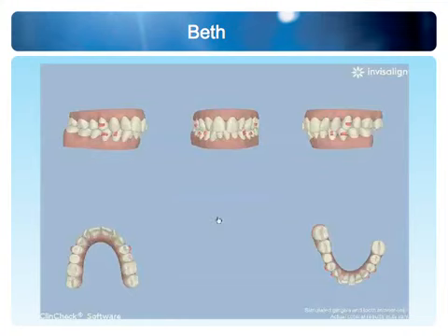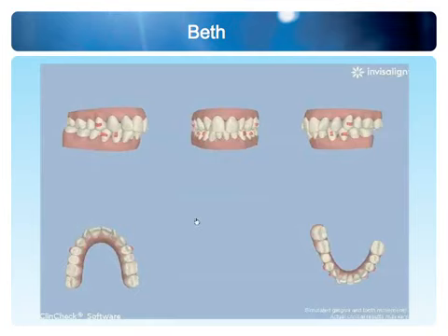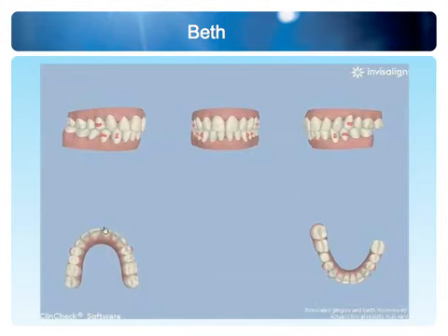I find that doing IPR in the anterior, the cutting and spinning technique, so to speak, doesn't work very well, and those teeth don't track nicely. But if we are expanding and creating the room, and then bringing the teeth into place without doing IPR in those areas, I find it tracks better. Let's press play and we'll look at that upper arch, and we will see a little molar and premolar expansion.